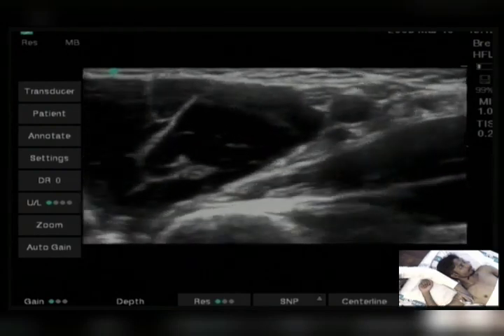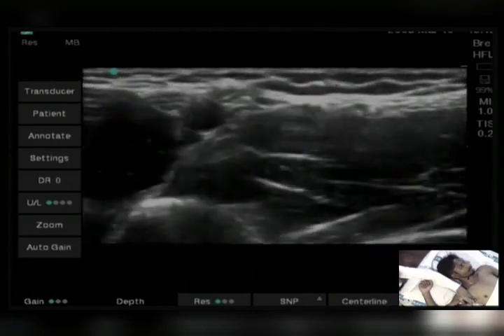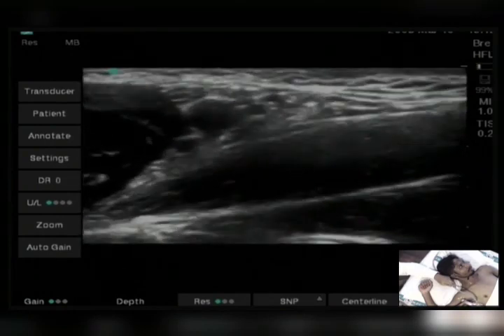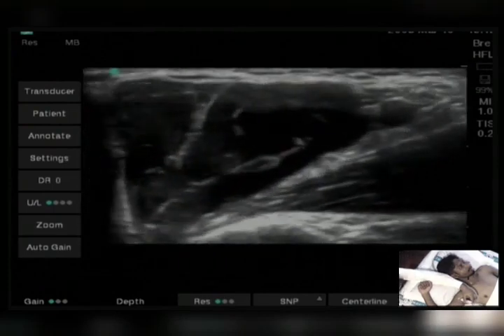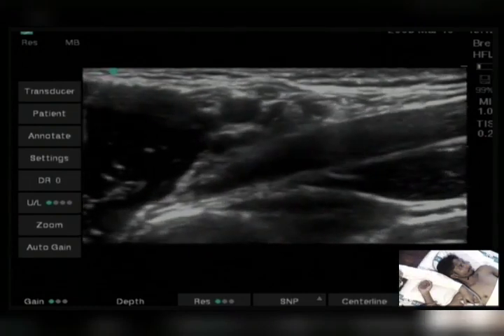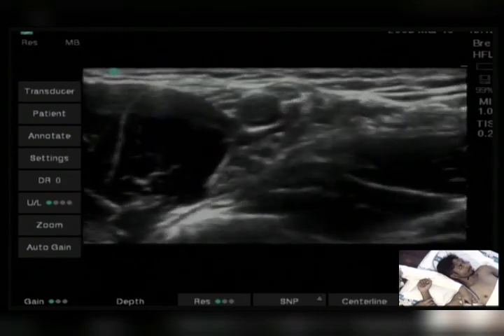When we trace the radial nerve distally, it will go into the spiral... Sorry, I am not stable with scanning. So it will fall down and reach the radial groove of the humerus bone. Okay, not properly getting, but this white structure is actually the radial nerve now.